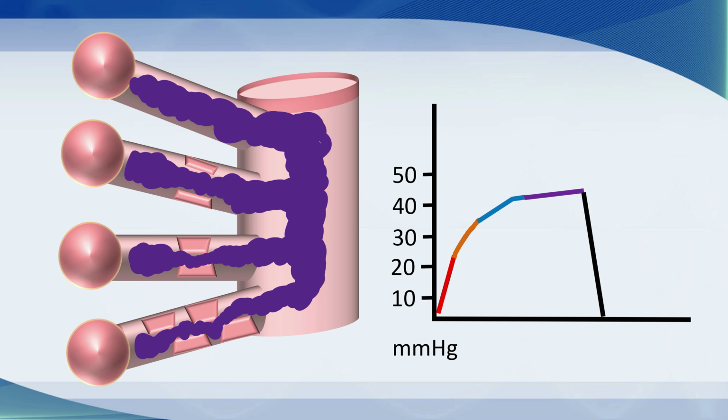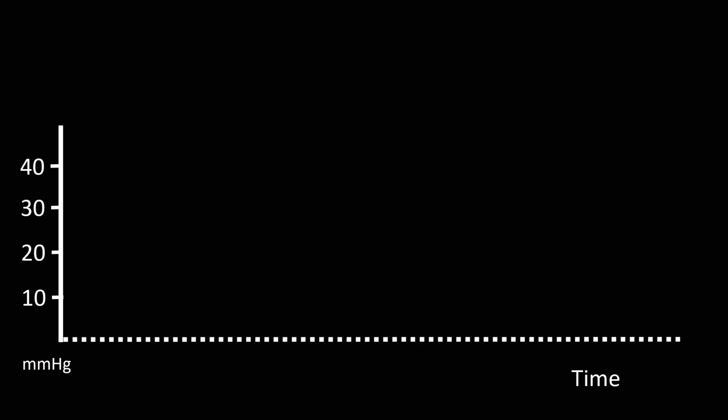And your job as a clinician is to see if there's anything you can do to improve this. Perhaps it's a chronic problem, or perhaps the patient has acute bronchospasm, and that's the characteristic CO2 trace you should be looking for. Here's another trace.